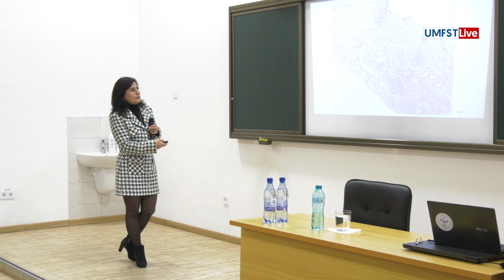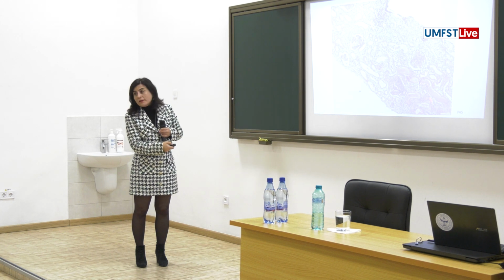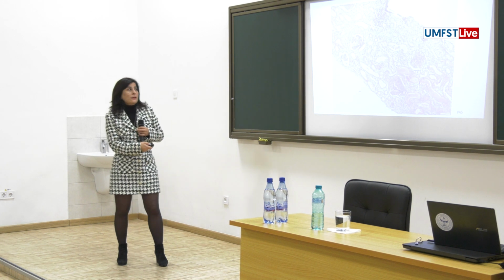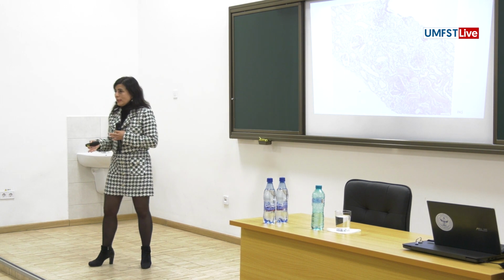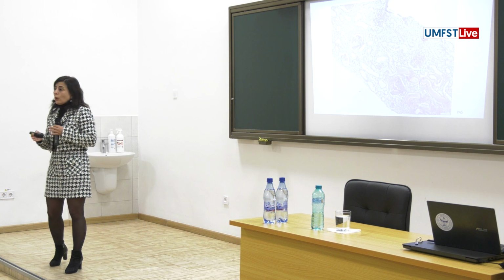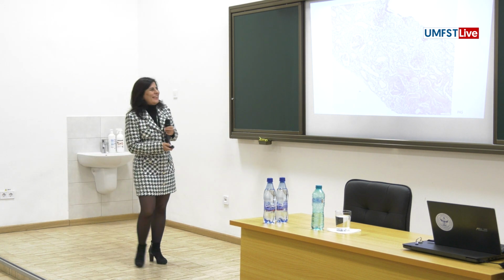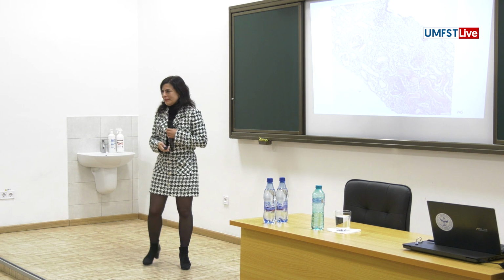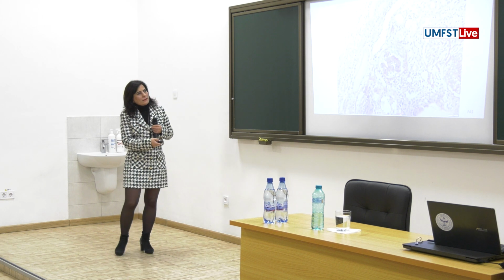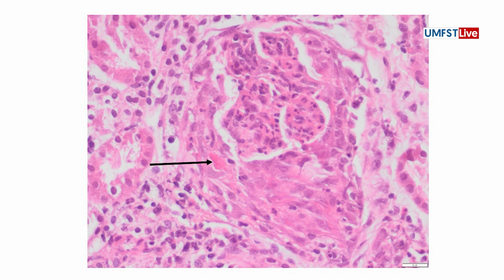And this is with PAS. There is some tubular dilation. Maybe there are some erythrocytes inside. This may be the sediment in the urinary fluid. And also hematuria, you're right. They can also see some sediments. It means activation of the case. This is PAS. You see the parietal cell proliferation, the crescent.